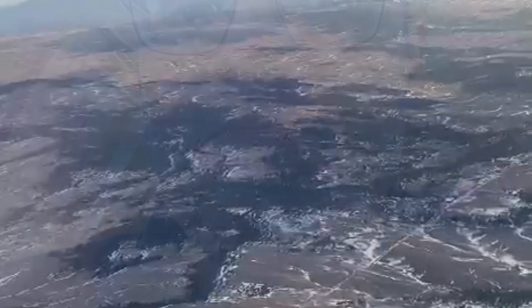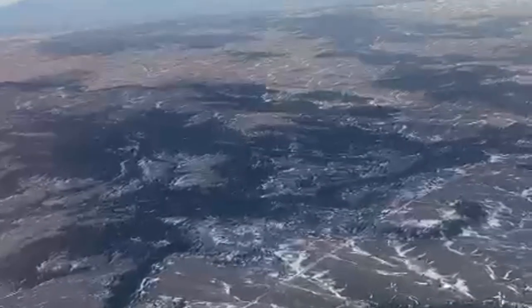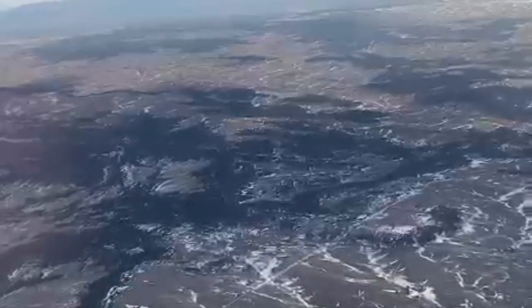With my dear colleague Mr. Abolfazl Gholami, through our video series today I'm going to show how to harvest or procure successfully from a patient with a known case of pulmonary thromboembolism. This is the third video that we are going to share in this respect with you. Accordingly, as you can see, this is the interstate heli board or jet board organ procurement as well as transplantation, including the lung as well as the LA cuff.